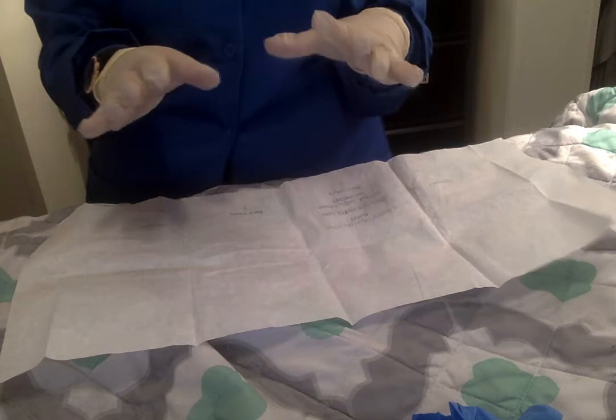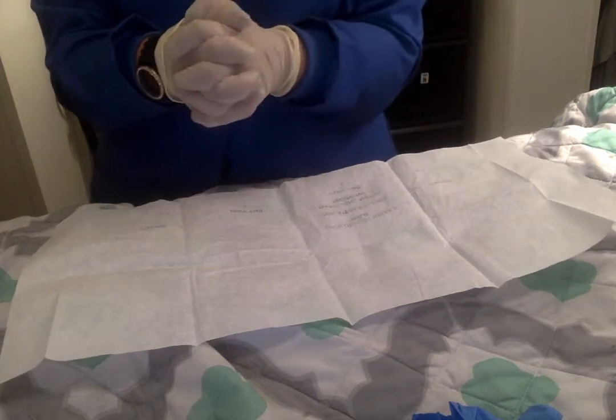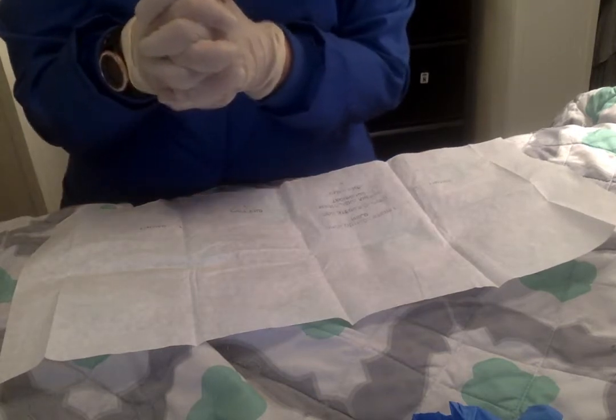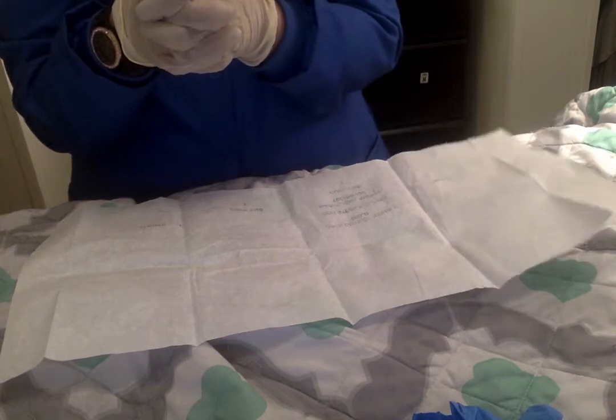Okay. And now that we have our sterile gloves, we're going to arrange all of the supplies on a sterile field, maintaining the sterility of gloves. We're going to open the packet of lubricant and squeeze it out onto the sterile field. Okay, so we'll do that right now.